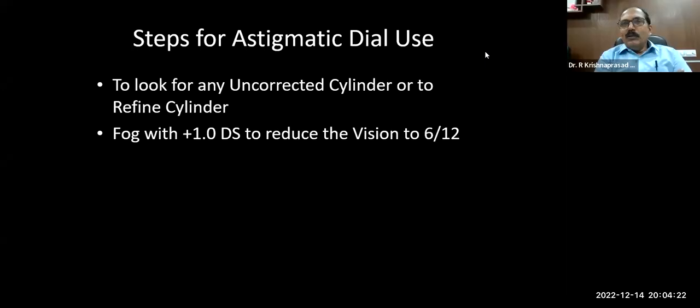Yes. So basically there are two reasons to do fogging. Fogging is simply putting a plus one or a plus 1.5 diopter sphere. Just put it on the trial frame. That's fogging. So what does fogging do?